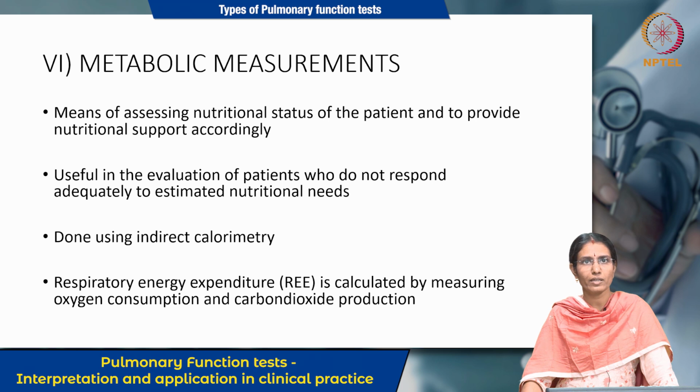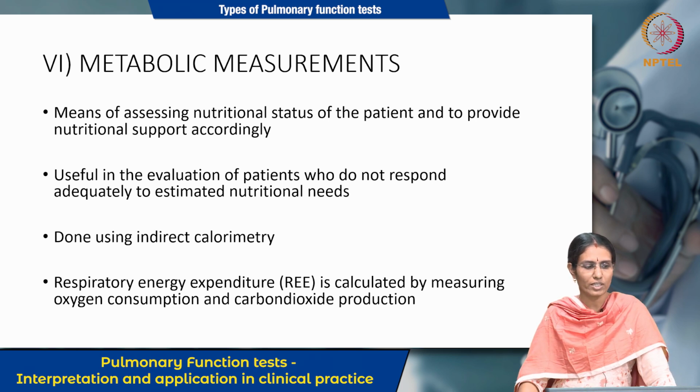And there are some other miscellaneous tests like metabolic measurements, which are not used very widely, but used in certain conditions, certain situations. These are means of assessing the nutritional status of the patient to provide nutritional support. They help in evaluating the patients who do not respond to the normal nutritional needs. And how is it done? It is done using the indirect calorimetry technique.